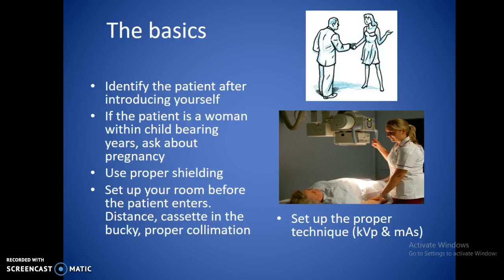The basics of this, just make sure you identify yourself. The introduction is going to be part of your practical exam, so you need to make sure that you go through all of these things. Use proper shielding, ask women in childbearing years if they could be pregnant, and then make sure your room is set up while they get dressed, including your technique and the cassette, marker, all that stuff.